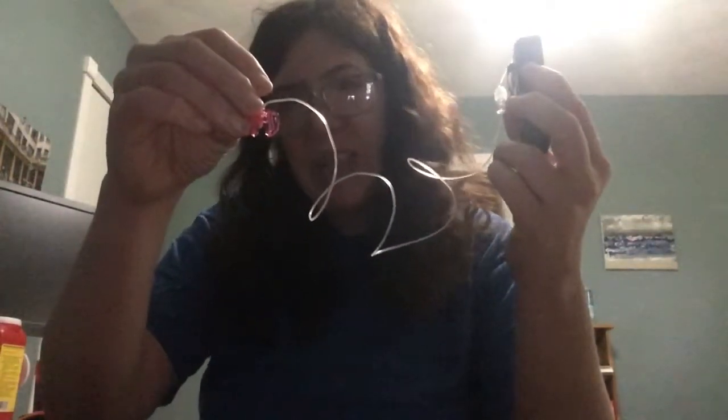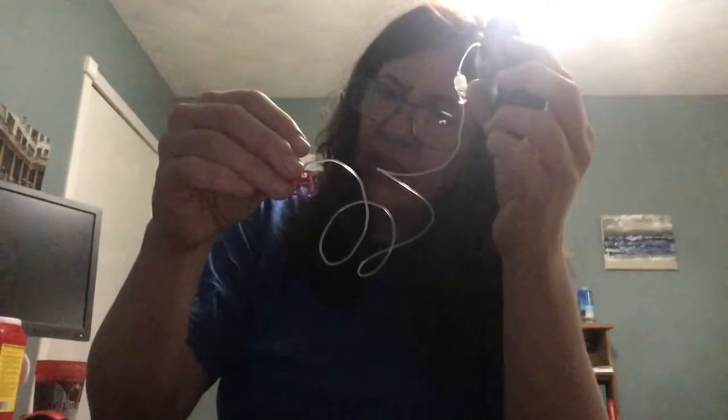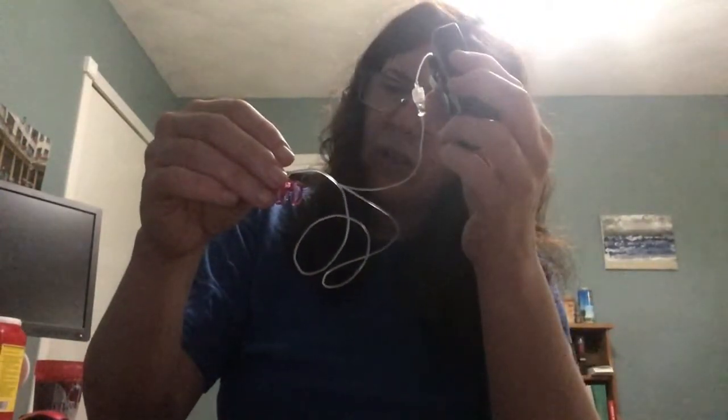I've been told you want to see 3 drops going. So 1, 2, 3, and stop. Now it is stopping fill. Detecting the insulin. Okay.